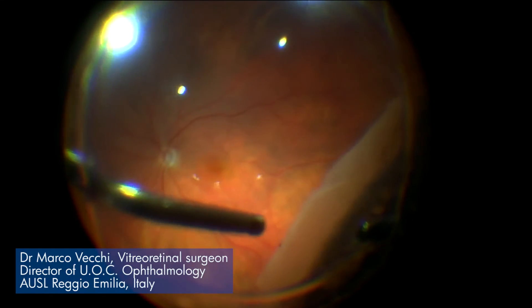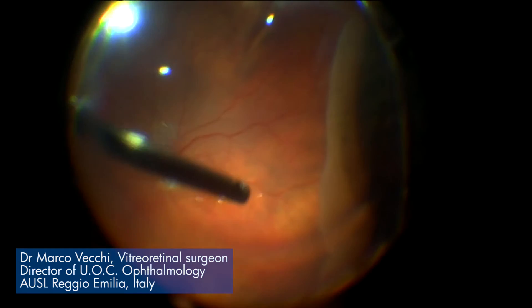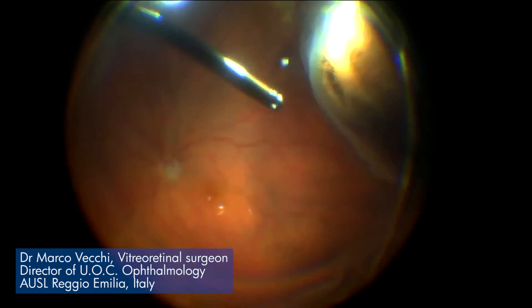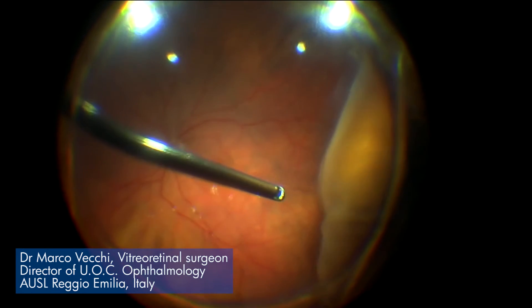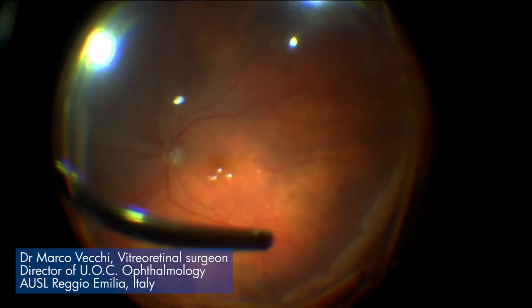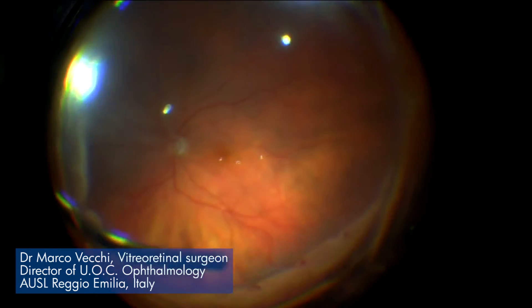First of all, the illumination — the lights are wonderful. All the lights can be adjusted in colour, in brightness, in every possible position. You can manage all your cases with the twin lights or with the end-pieces, with as much light as you want and a very comfortable flexibility in your surgery. The module for the vitreoretinal surgeon is simply fantastic.